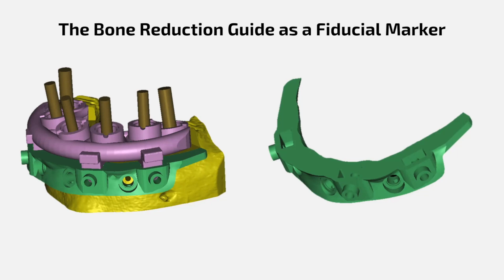So if you are using a bone reduction guide as a fiducial marker, we do recommend having one that is fixated with screws. We also recommend that after it's been printed in that clear material that's strong and made for these types of guides, you paint it with OptiGlaze or something like that, some opaque color on the top of the guide so that it is easier to scan when you're ready to do that scan.